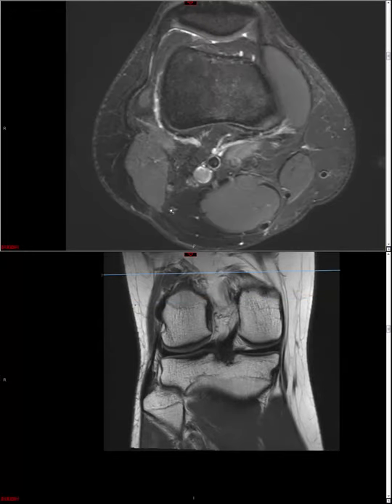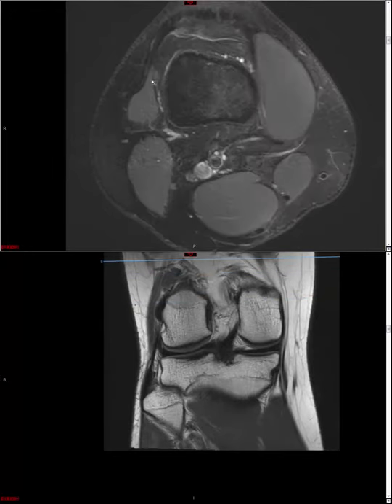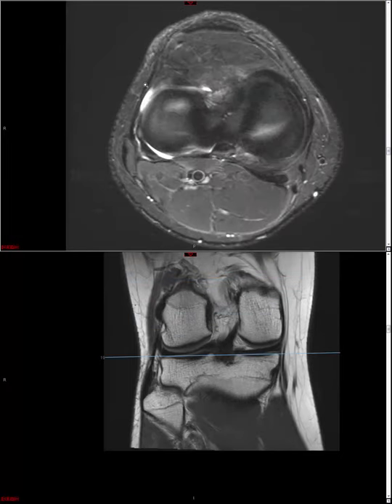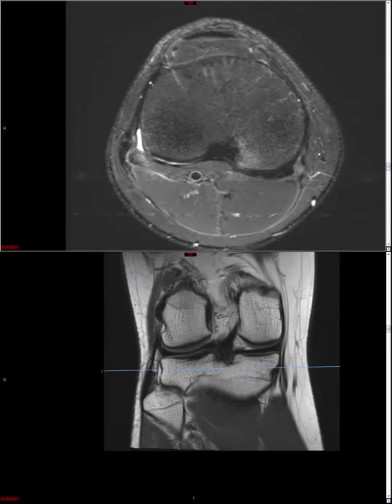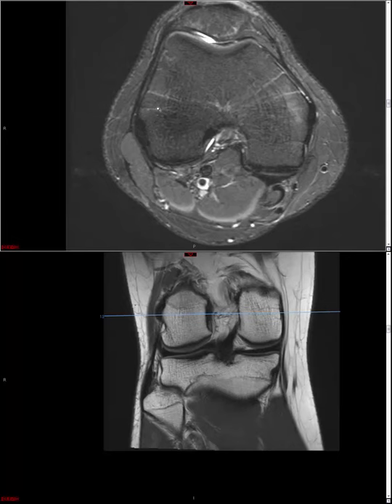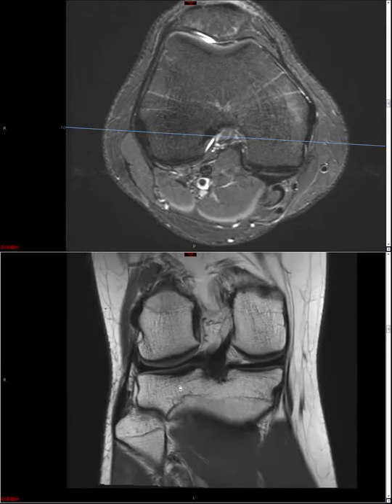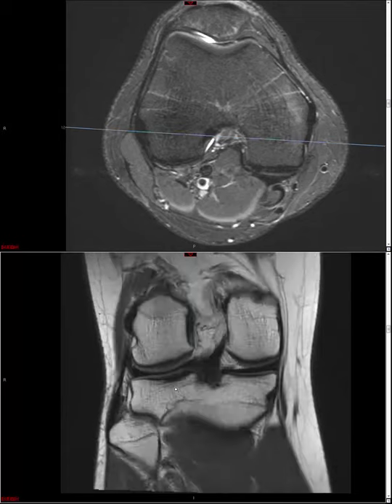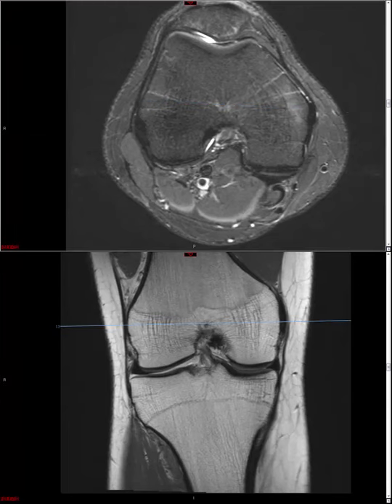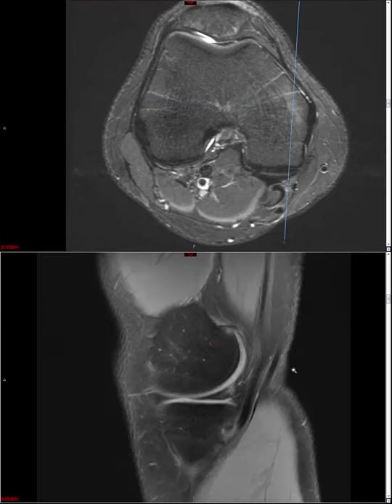And of course the iliotibial band, the most anterior structure, which is shown quite nicely here, and you can see it inserting on Gerdy's tubercle here at the anterolateral aspect of the proximal tibia. Increasingly, the literature has talked about something called the anterolateral ligament, but I'll let you explore that on your own. I don't think it's critical to know about the anterolateral ligament at this time, but just be aware that there are new structures that we'll eventually have to look at in detail as well.